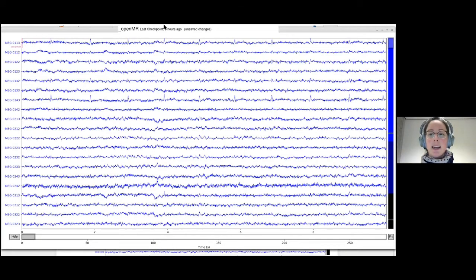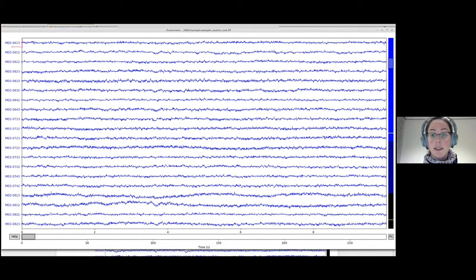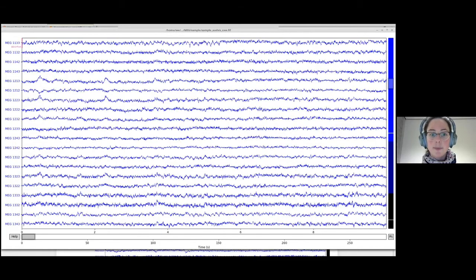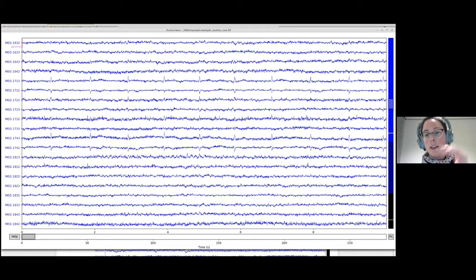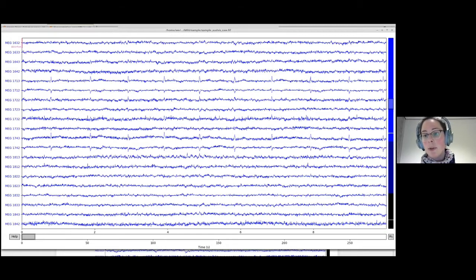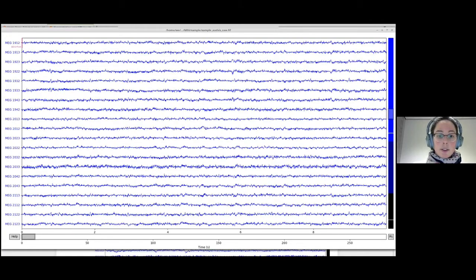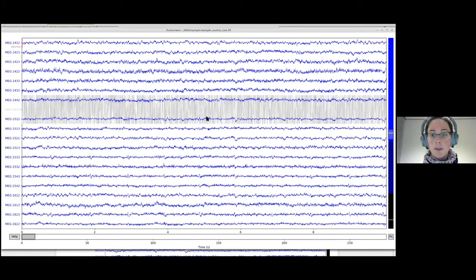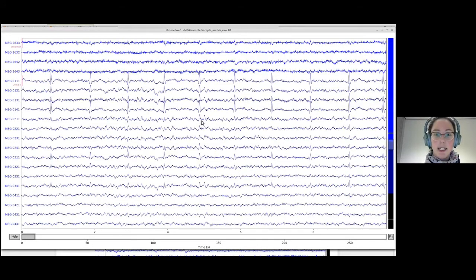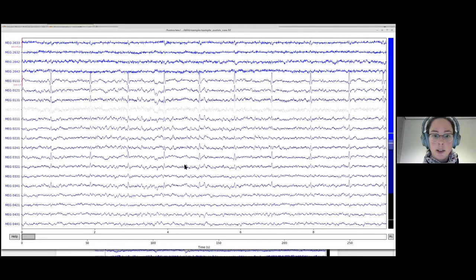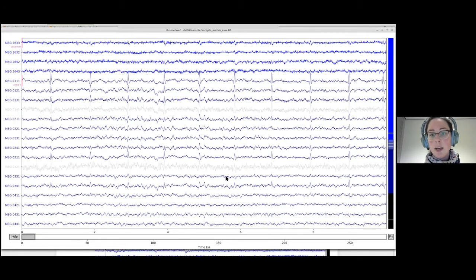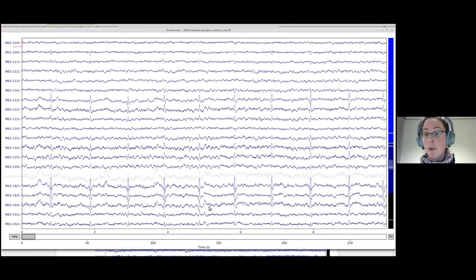The dataset we are using had auditory and visual cues presented to participants, either in their left or right visual field, or the left or right ear. We have loaded those raw data and made a copy for plotting. With just this plot command, we can now plot the raw data. Here it is — you can scroll through to look at all your data. On the left you can see the different channel numbers. You can see we have MEG channels. We have MEG gradiometers in light blue, MEG magnetometers in dark blue, as well as EEG data, EOG data, and stimulus channels. One channel is already grayed out as detected bad.